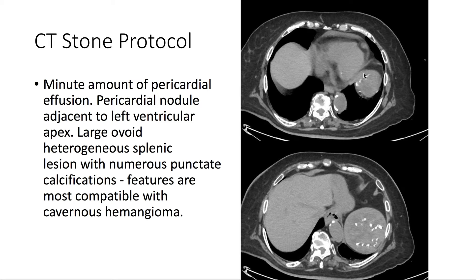There's a large ovoid, heterogeneous splenic lesion with numerous punctate calcifications, findings most compatible with cavernous hemangioma.